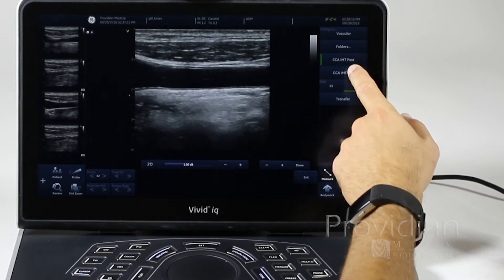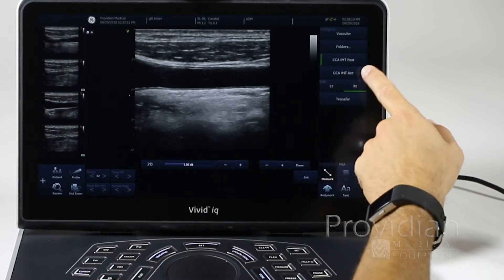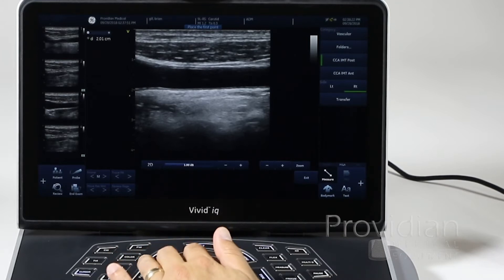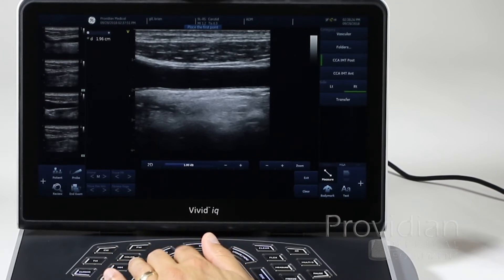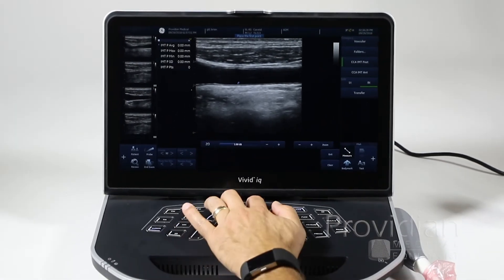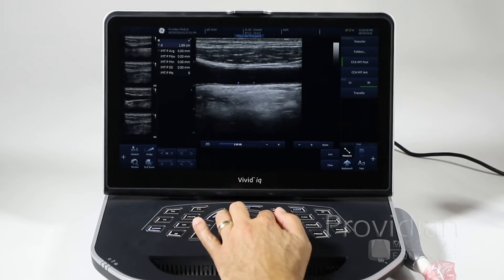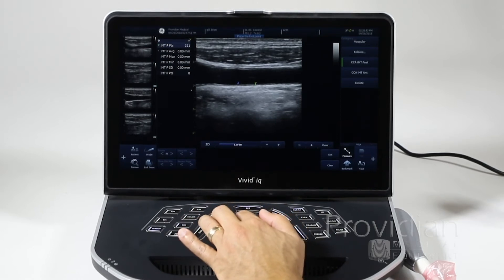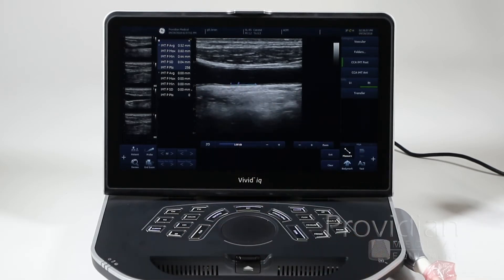I just want to do the IMT. Here's IMT post, right side. I'm going to go ahead and move that trackball, click set or double click there, and double click again. Double click again, and it did the auto IMT for me already.